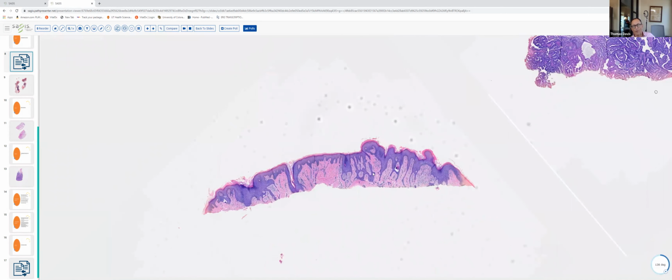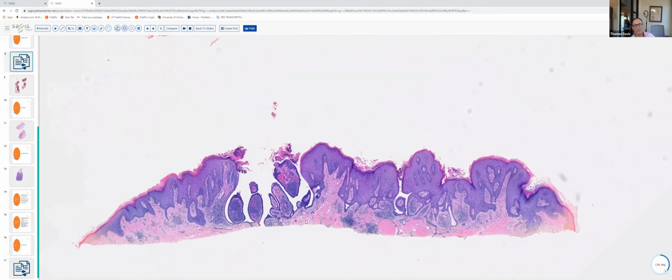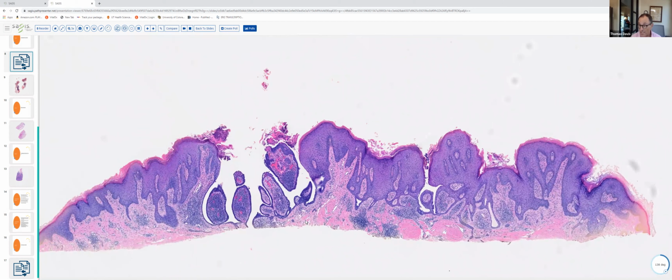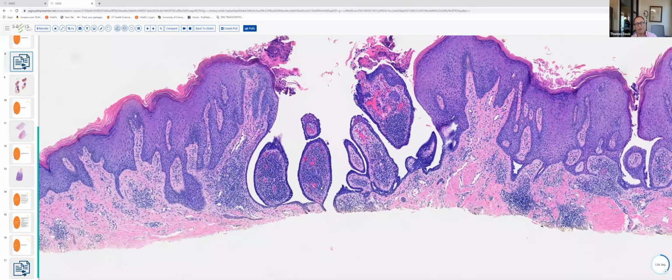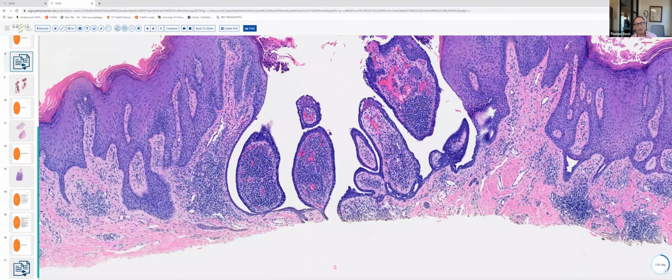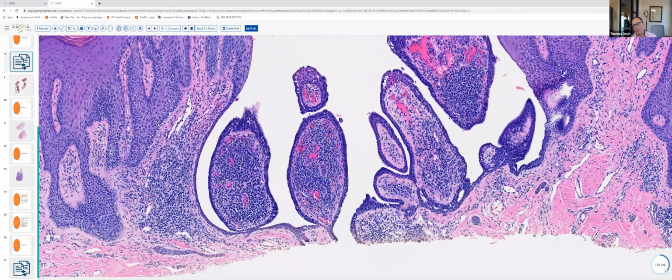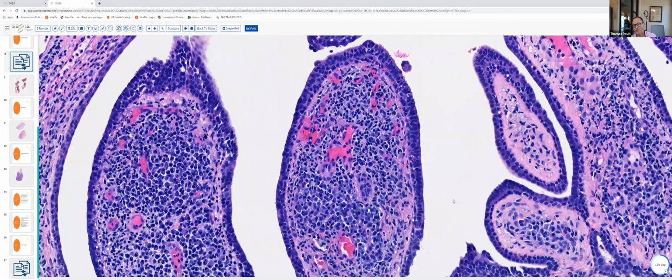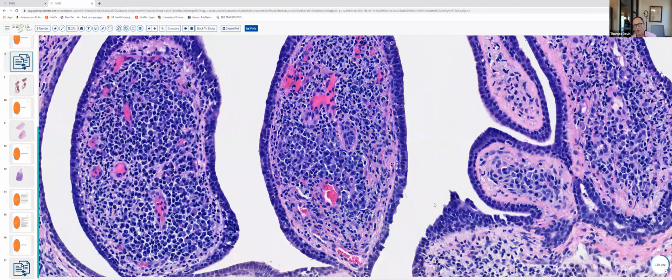Both Hidradenoma papilliferum and syringocystadenoma papilliferum are glandular tumors that show differentiation towards the secretory portion of the sweat gland apparatus. And like a Hidradenoma papilliferum, syringocystadenoma papilliferum is also characterized by these papillary projections that have a very similar lining, kind of this high cuboidal epithelium, and usually evidence of decapitation secretion along the luminal aspect.